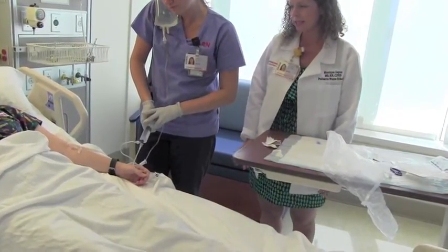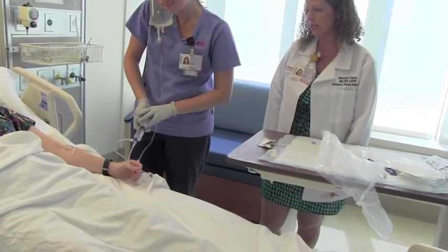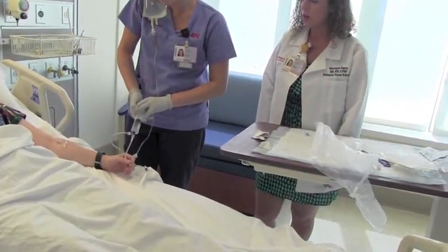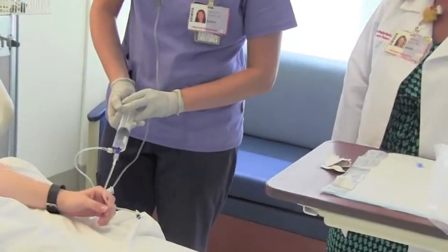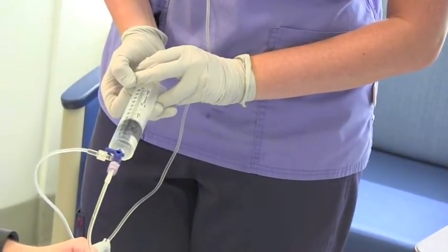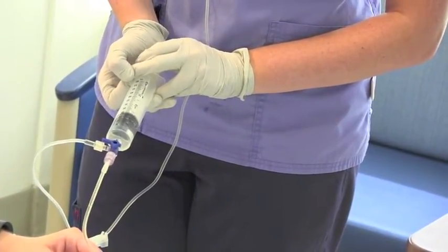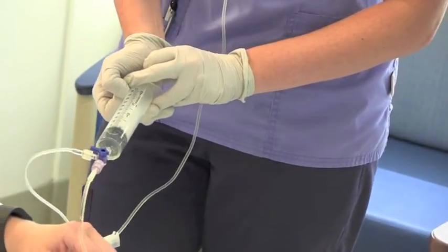Now you're going to meet resistance depending on the length and the gauge of the patient's IV. And you also want to monitor for signs and symptoms of IV infiltration and extravasation during your push-pull, because you are going to be pushing with force and you might encounter some resistance.